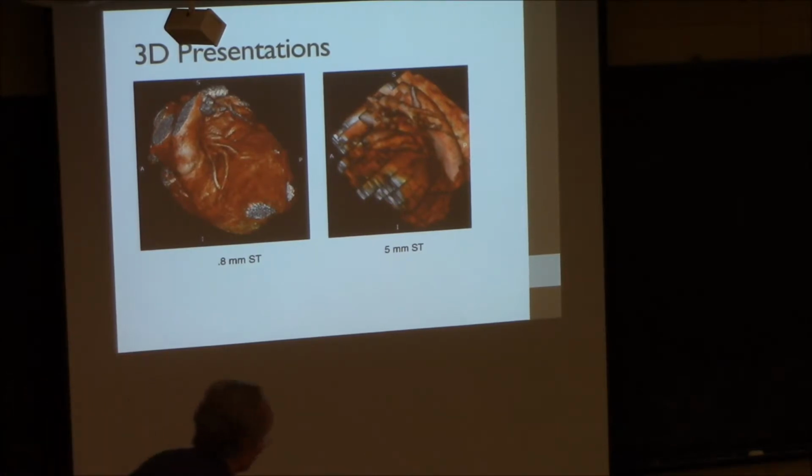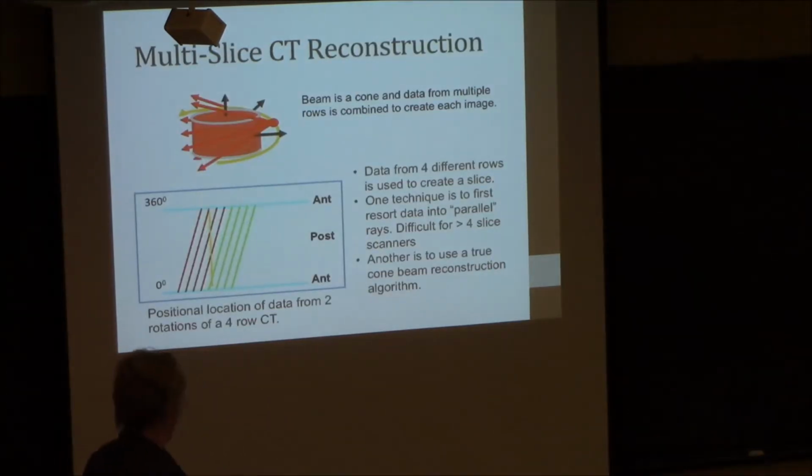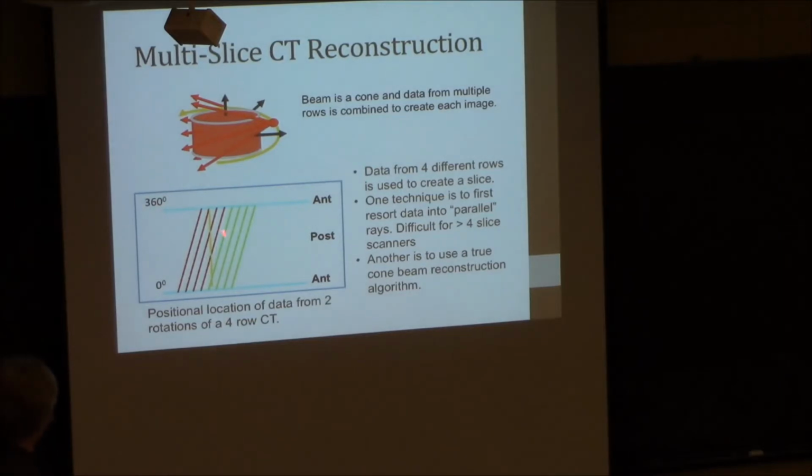If you look at that, the nice thing about this is that when you get done, you can pretty much create any slice of any thinness that you want. You're not stuck with the point and shoot, where you did a slice that was 1 centimeter wide, you'd move 1 centimeter and do another one, and that's the thickness you had of a slice. Here, you can just go through with this data and cut it any way you want.